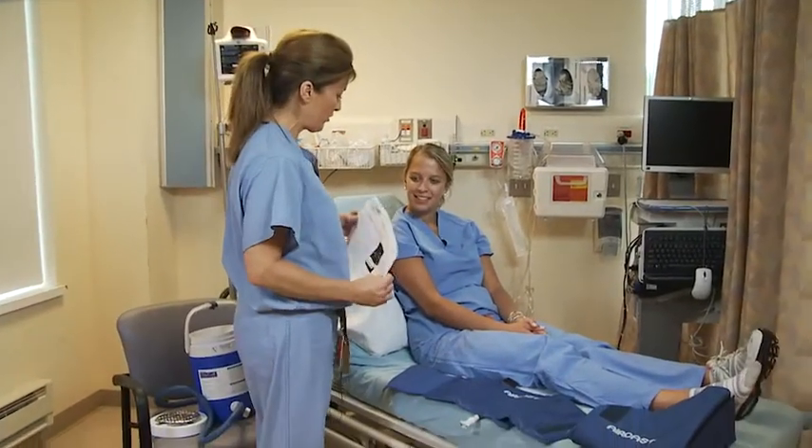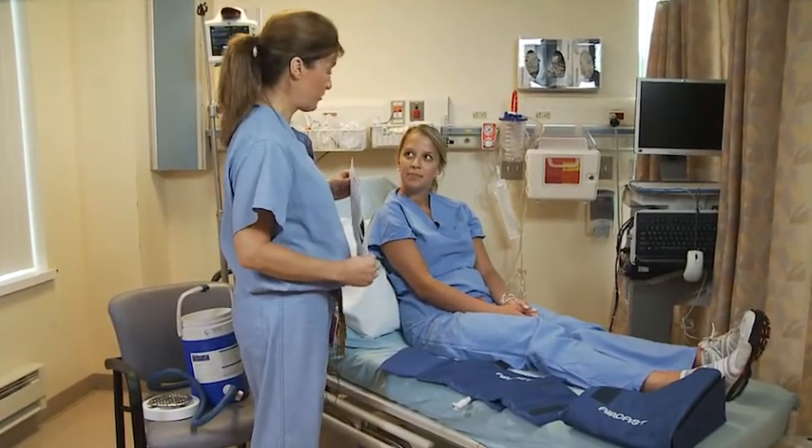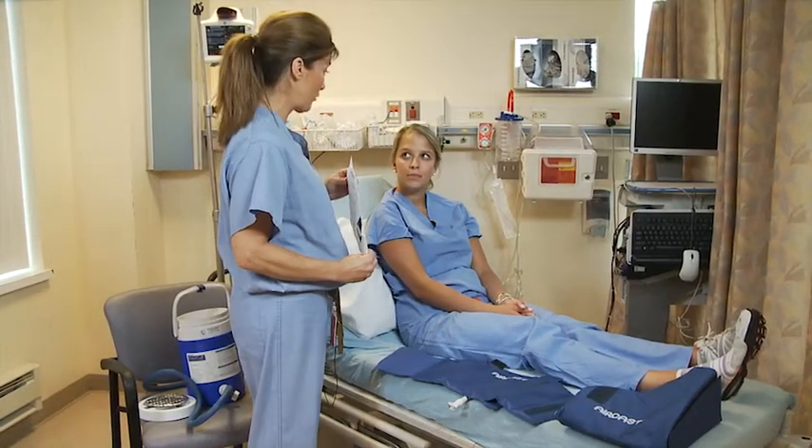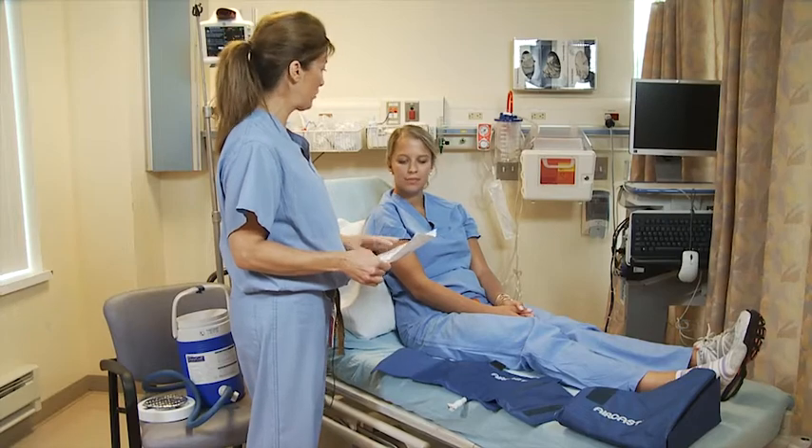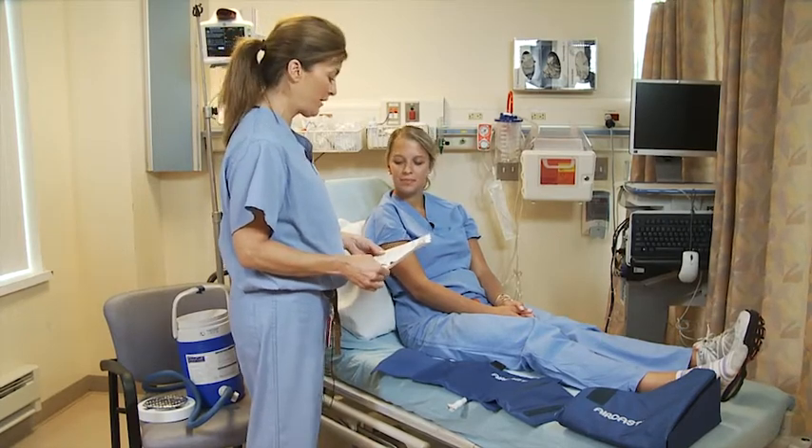Hi, Sarah. I'm Laurie. I'm going to instruct you on the use of the CryoCuff to give you ice therapy at your post-op care. I'm going to review everything, but I will send you home with an instruction sheet that you can reference if you need to go over anything at home.